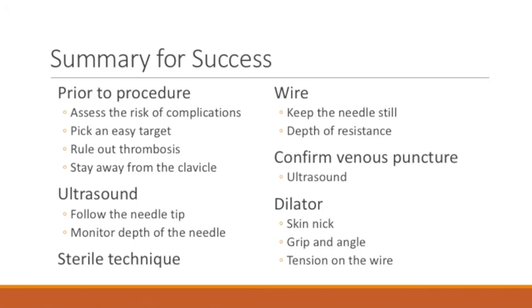And if you're struggling with the dilator, take a pause with the dilator, re-inspect your skin nick to make sure you didn't leave an extra tag of skin there, adjust your grip and angle of the catheter, and then make sure to pull back on the wire and maintain constant tension on that wire as that dilator is advancing through. And if you stick to these, you're going to be very successful and continue to grow in your skills as you progress. All right, that's all I got for now. Thanks for listening.